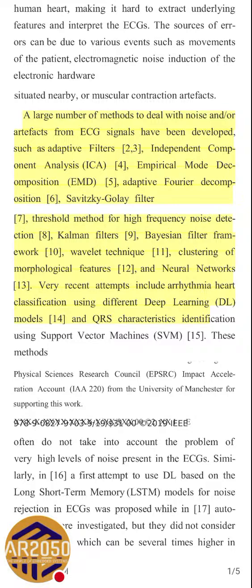But if we do an independent component analysis, we will just learn the nature of the noise, and we will decompose the actual signal into multiple components, and then we will get a component of the noise, and we remove that component from the original signal. So even if the frequency overlaps, that frequency is not lost if the original signal also contains a similar frequency.